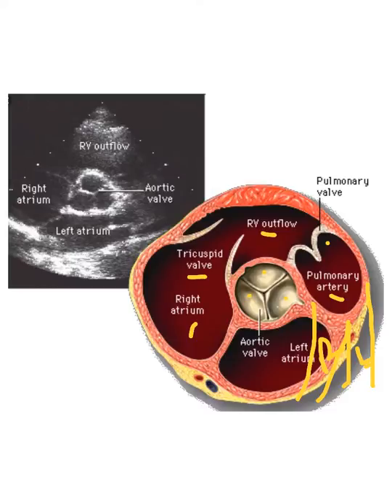And I can give you those. The one over here is the left coronary cusp. The one up here is the right coronary cusp, and the one down here is the non-coronary cusp. So you can see the edge right here. You can see a little outcropping. That's the beginning of the left coronary artery. And this little outcropping here is the right coronary artery.